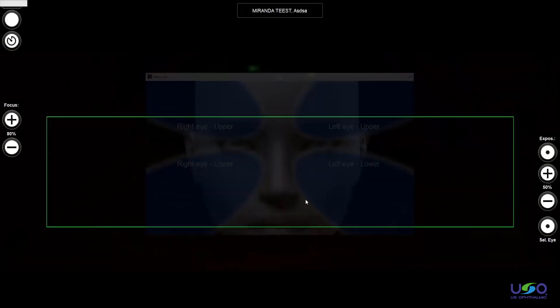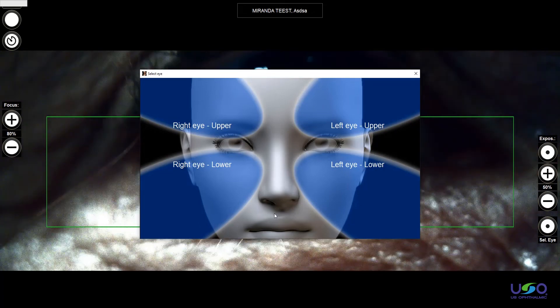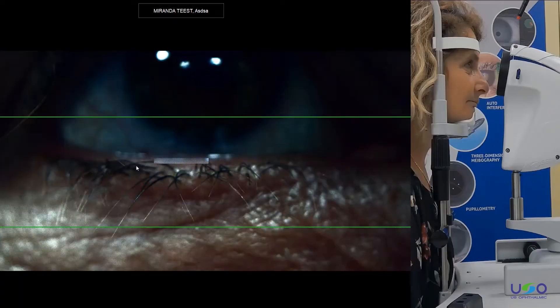Starting meibography. Remember that now you don't have to just select right eye or left eye, but we have right upper and lower, left upper and lower. Of course we can analyze all the lids — it depends on the use of the doctor. I will do a right lower detection.